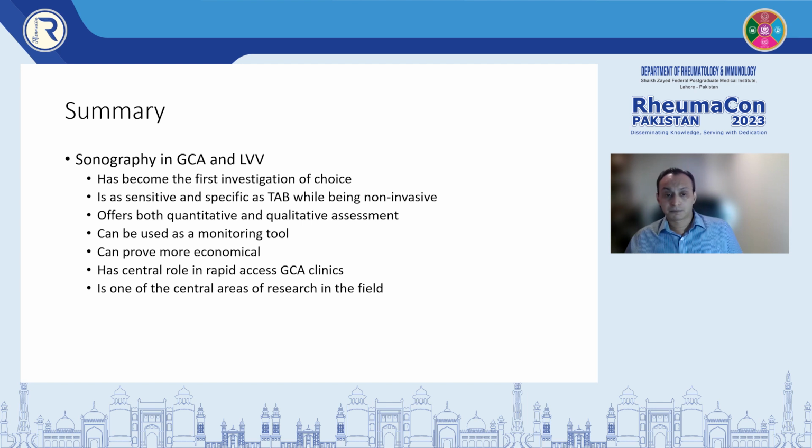And we can perform both qualitative and quantitative assessments. Like in temporal artery biopsy, you can't keep going back and doing biopsy again and again. In ultrasound, you can go back again and again and reassess the situation, and you can use it as a monitoring tool as well.